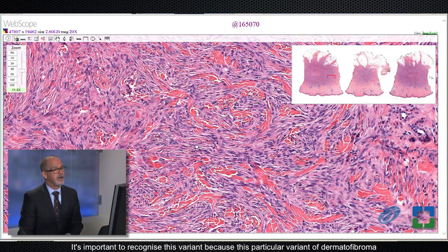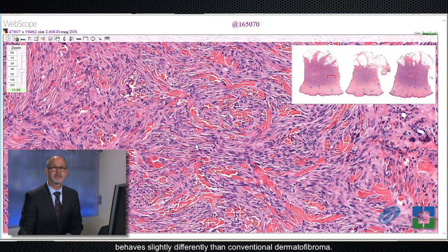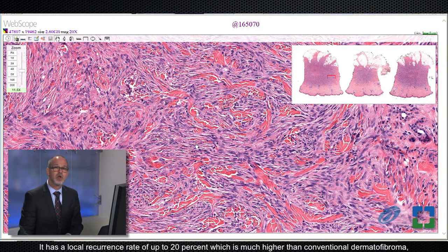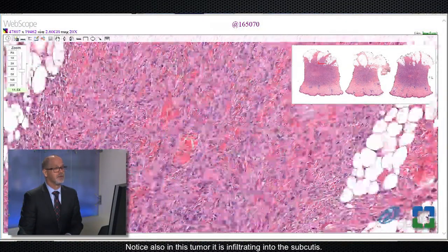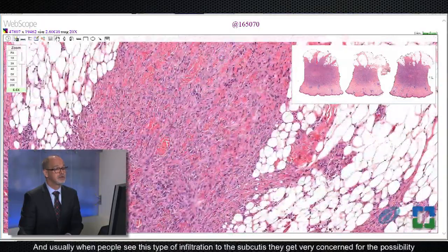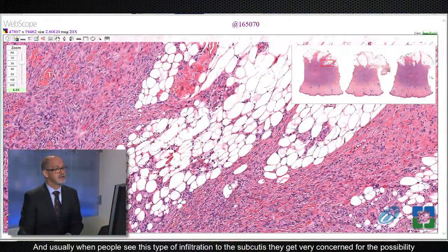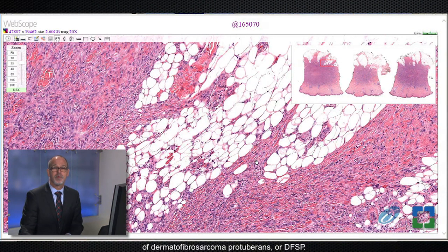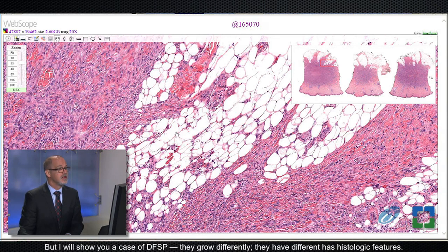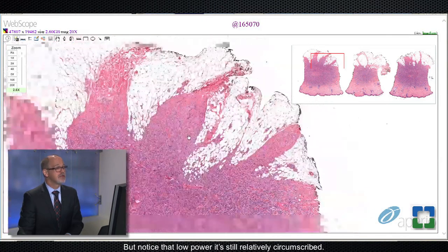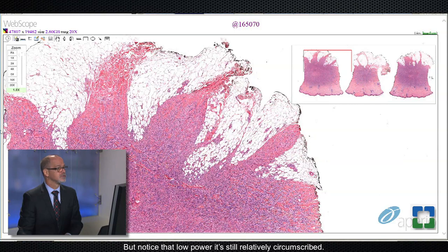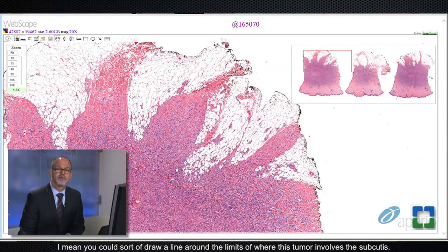It's important to recognize this variant because it behaves slightly differently than conventional dermatofibroma. It has a local recurrence rate of up to 20%, much higher than conventional dermatofibromas, which recur around 5% of the time. Notice also that this tumor is infiltrating into the subcutis, which usually causes concern for dermatofibrosarcoma protuberans (DFSP). But when we see cellular fibrous histiocytoma infiltrating the subcutis, at low power it's still relatively circumscribed — you can draw a line around the limits of where this tumor involves the subcutis.